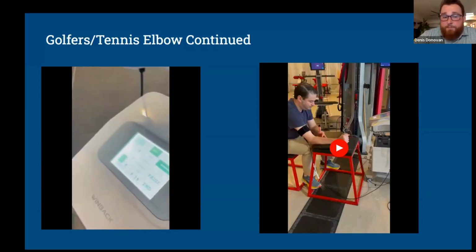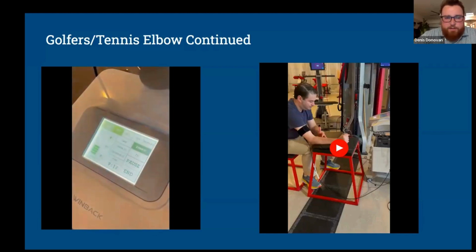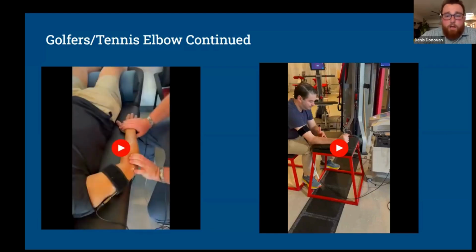I'm cueing him for submaximal effort. I believe this was one of the first times we did it, so I didn't need him to give me a whole lot, but I just wanted a concentration of that current in the tissue that was contracting. Anyone who's heard me talk on any of these calls has heard me talk about how much I love doing stuff actively because it really improves the specificity of the treatment. We'll talk about some other ways that we can do that, but placing a contractile load on pathologic tissue is a really great way to improve the accuracy of what we're doing.